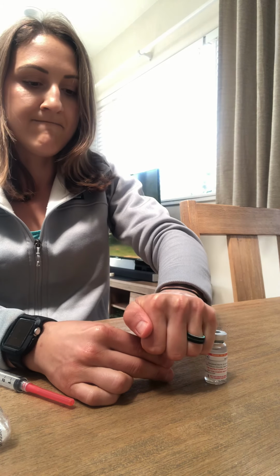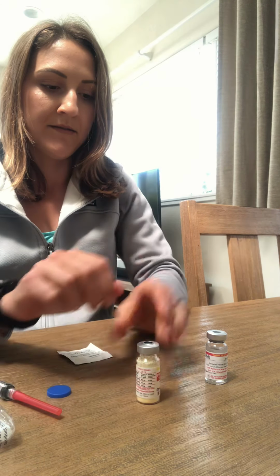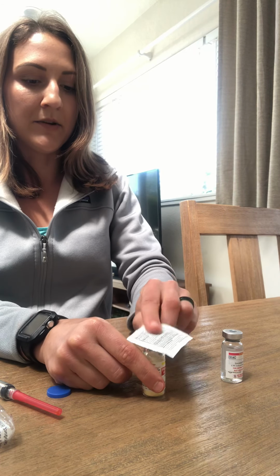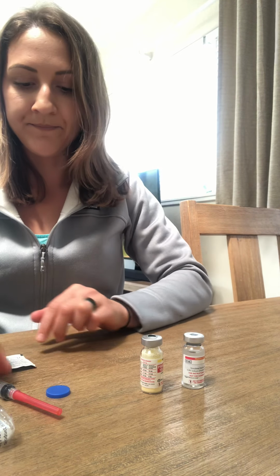I've already verified the order, and I've already gathered my supplies, so I'm going to be removing the vial caps from the medication. Remove the vial cap, and then I'm going to be cleansing the port and allowing them to air dry.